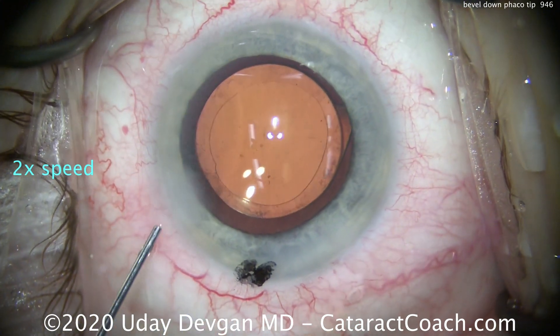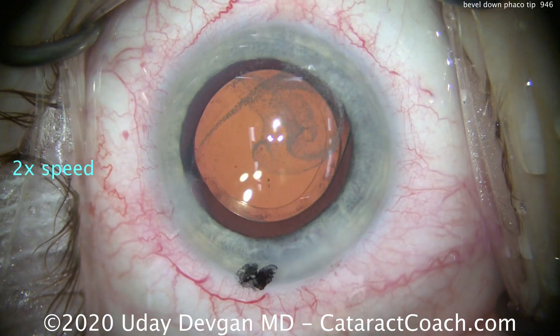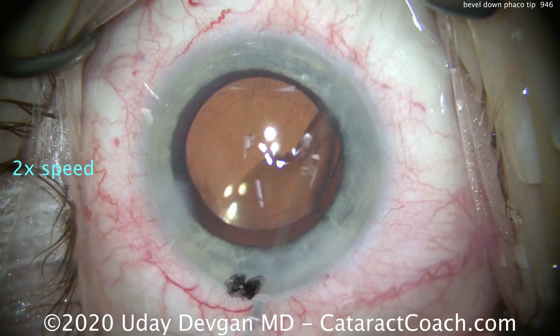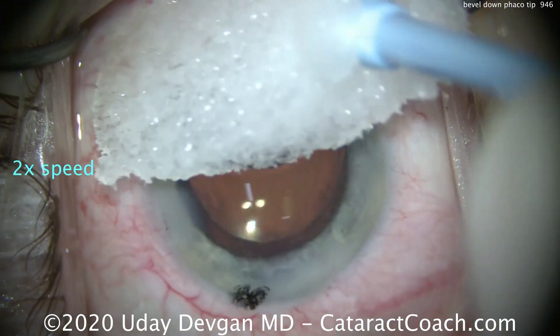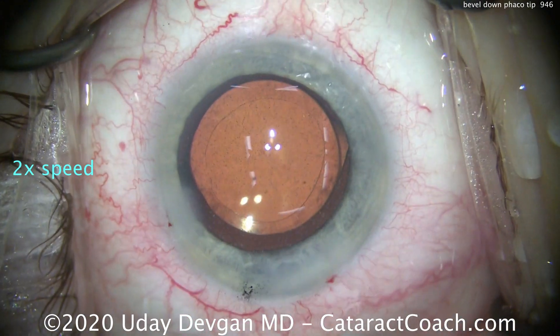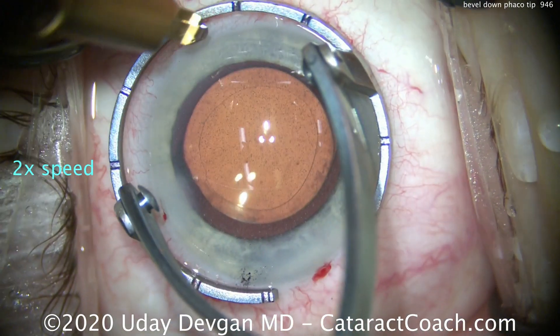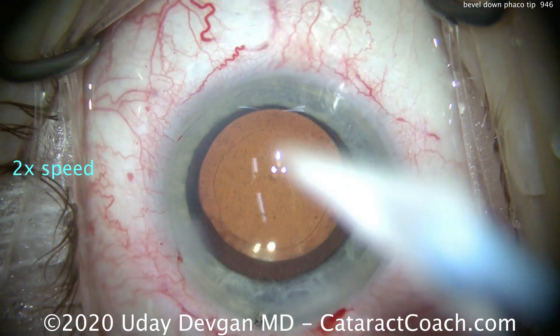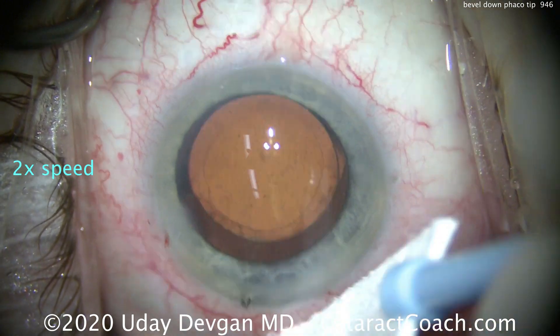Therefore, my advice to you is for doing phaco chop — if you're going to do it my technique — go bevel down. I hope that helps to answer the question of why I always go bevel down. It's a pretty common question; I probably get an email or two every single week asking me that. So this is the answer to the question.